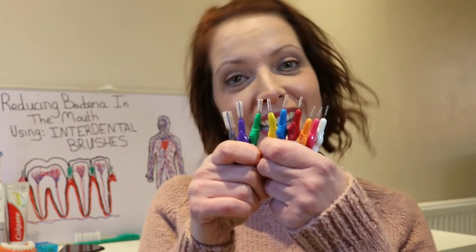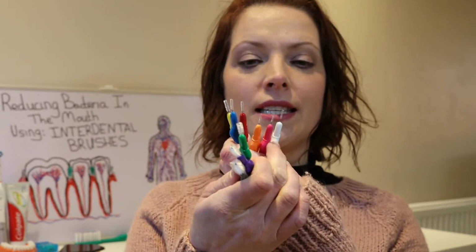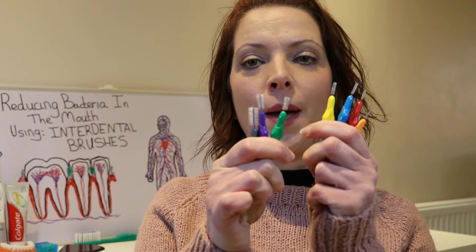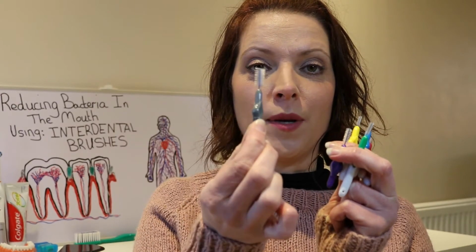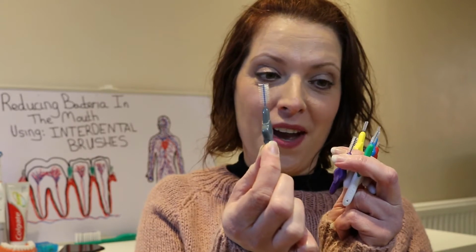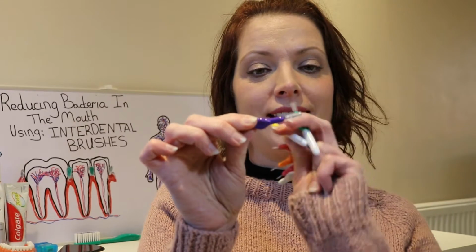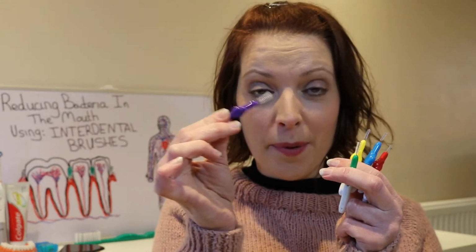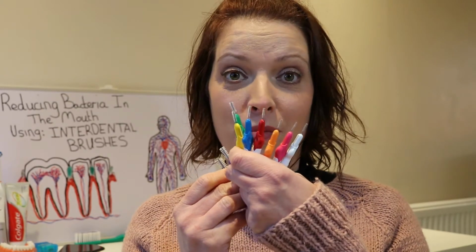So interdental brushes come in all different sizes to suit individual needs. We range from white at the smallest, then we've got pink, orange, red, blue, yellow, green, purple and grey. This is quite a large one, so this would probably be suitable for somebody who's got a tooth missing and could clean in between the gap with that. And the purple one is also quite a large one, and again it could be for somebody who's had a tooth removed at some point and they've got a little gap. They're also really good for cleaning if you've got fixed braces and you want to clean between your brackets.